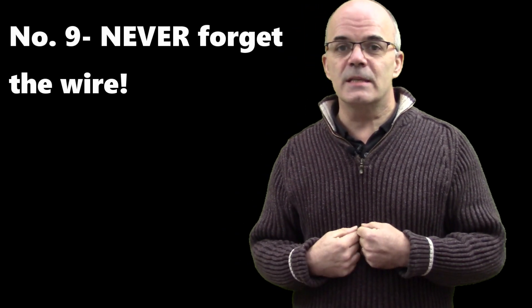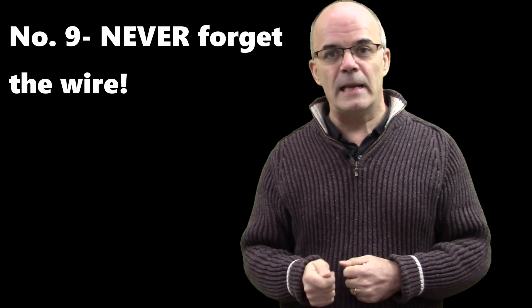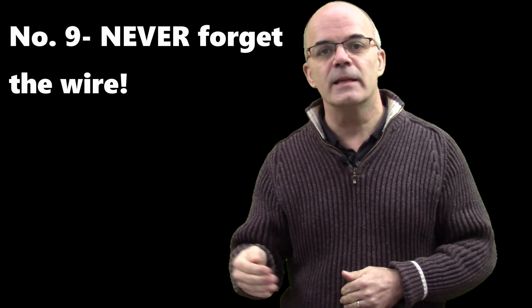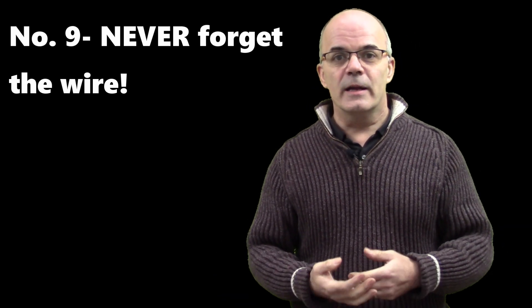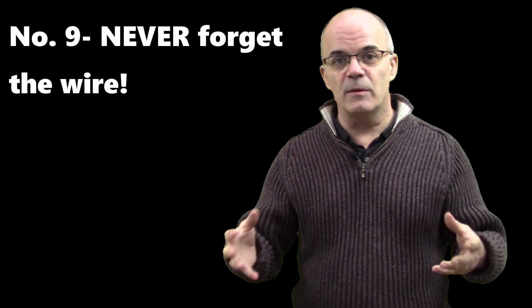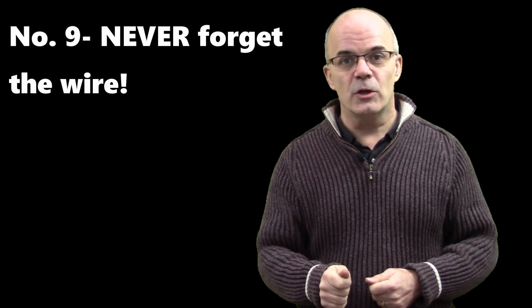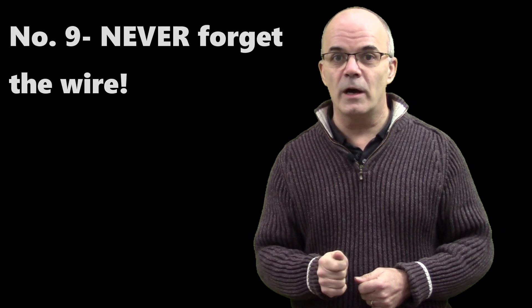Number nine — and this is a tip from me. When I take the wire out, I always say quite loudly: 'The patient's wire is out and I'm putting it on the trolley.' I say it so that the nurse assisting me will hear it. That saves my panic when I'm clearing everything away at the end and can't remember if the wire is out or not. The nurse heard me say it before I closed up, and I've double-checked. So say it, say it loudly, make sure somebody hears you — that hopefully ensures you've done it. You don't want to be leaving those wires in.